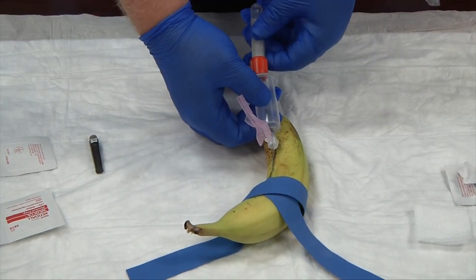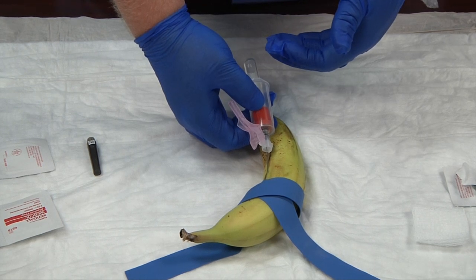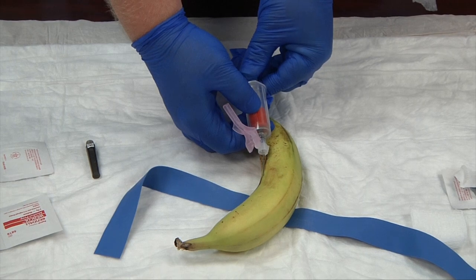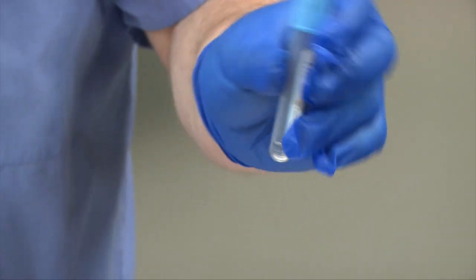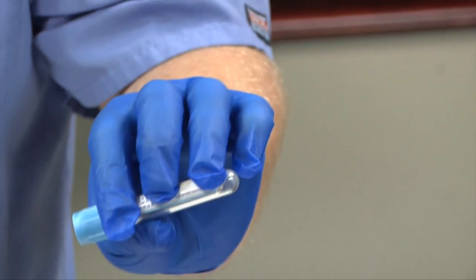Get your next tube, needle down. This will be our last tube, so before we disengage it, we release the tourniquet. Then disengage the tube and invert it three to five times. You want to invert your tubes slowly, three to five times each, depending on the chemical. Don't shake it roughly — this causes hemolysis. Go slow, gently inverting the blood into the chemical mixture.